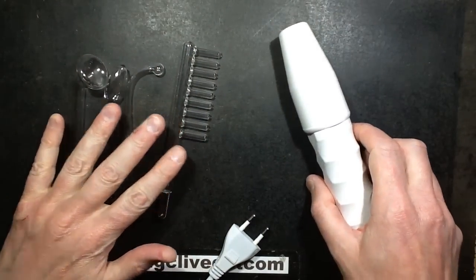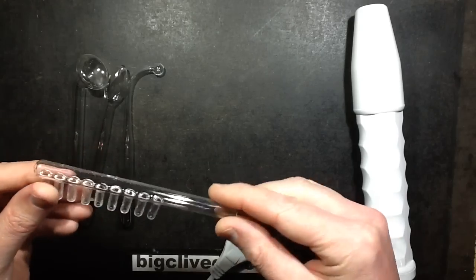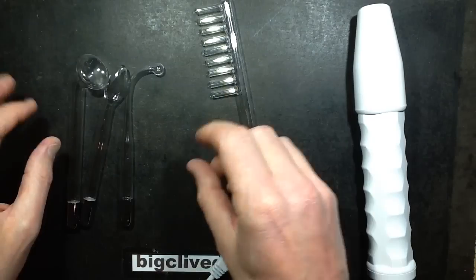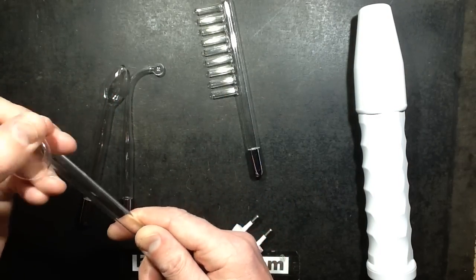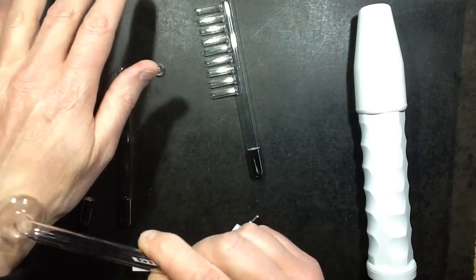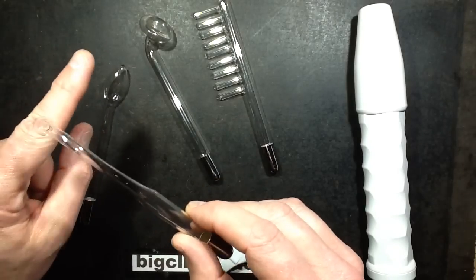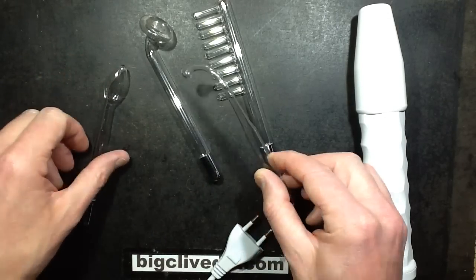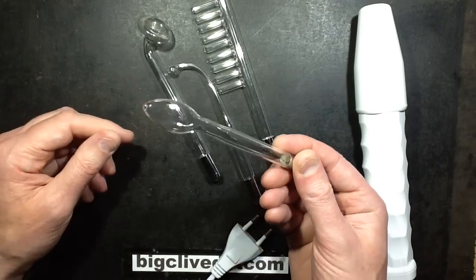It came with four electrodes. One is the comb electrode for doing your hair, energizing your hair. One is the general mushroom electrode, which is probably one of the most stereotypical electrodes. It's used for applying over the skin. I guess this is probably a spot one for spots. And I haven't a clue what this one's for. Maybe it's for the eyes because it's sort of eye-shaped.